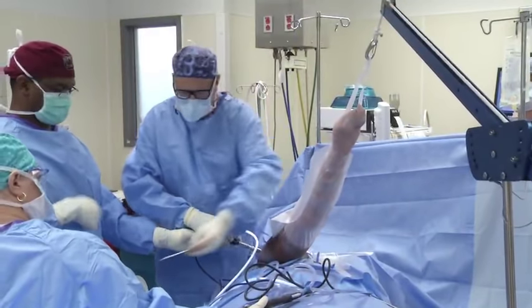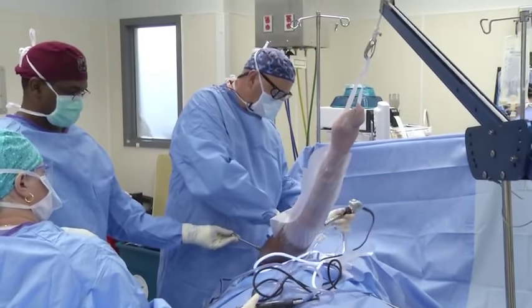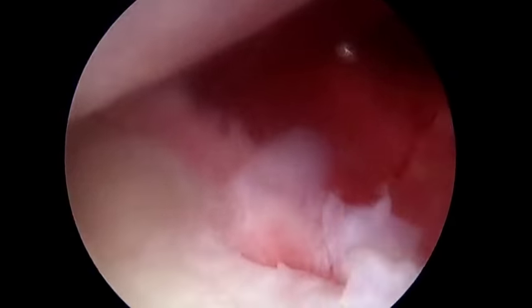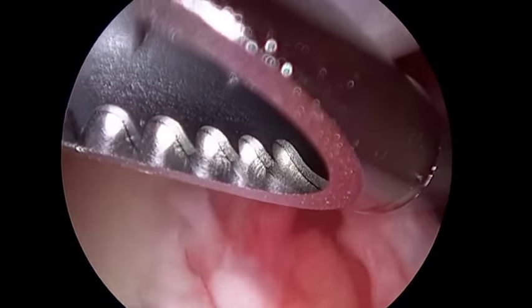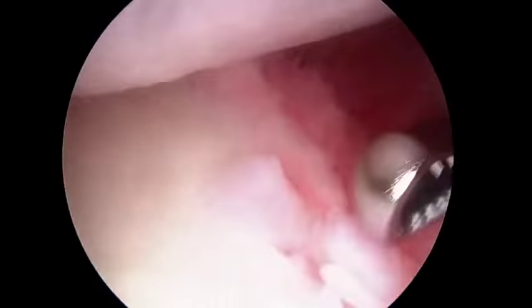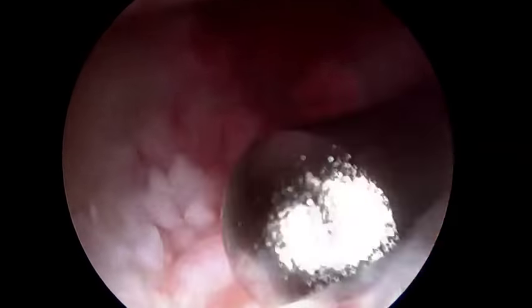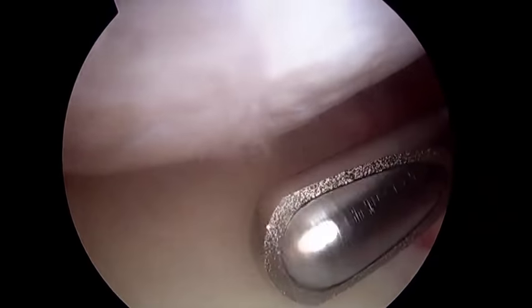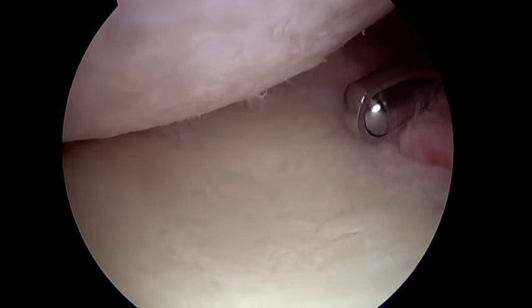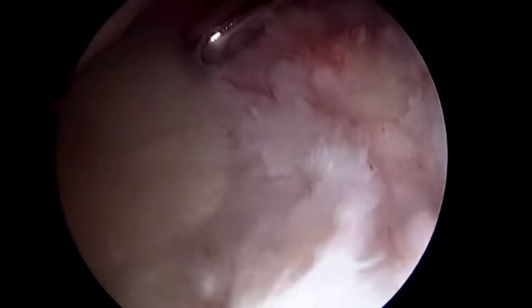Okay. Now we're going to flip-flop portals because we like to see the shoulder in 360 degrees. We're going to go in through the anterior portal and look at the posterior structures a little bit better. And as you can see back here, it's red. Again, we're going to just clean this out for her. As I said, a little wear on the humeral head and glenoid. Back part of the cuff looks good. Just a lot of inflammation.